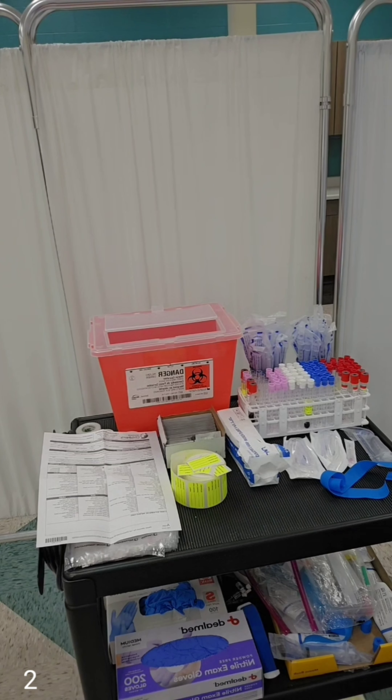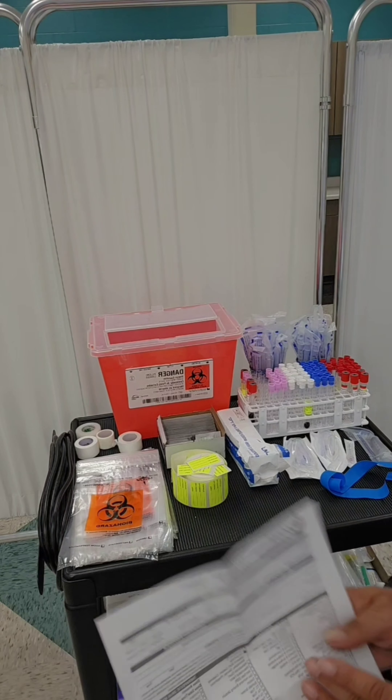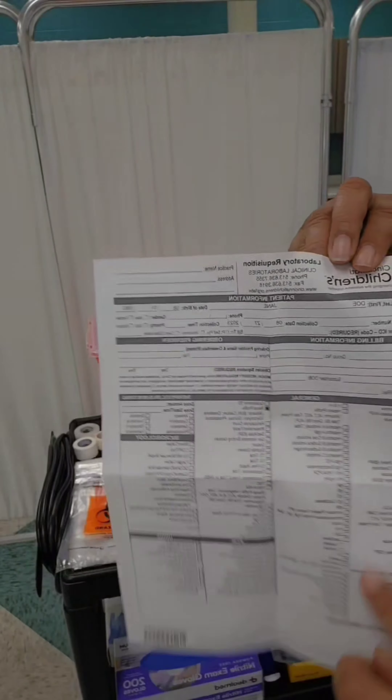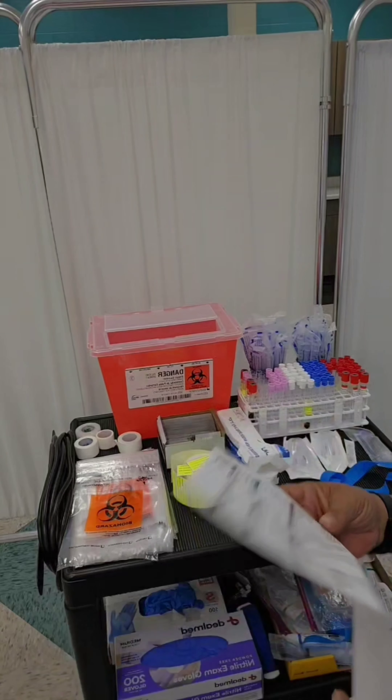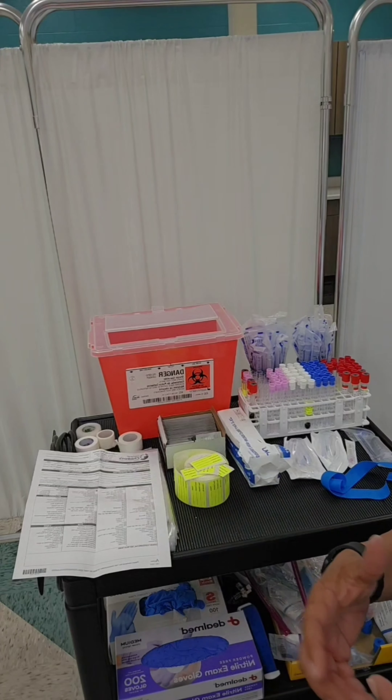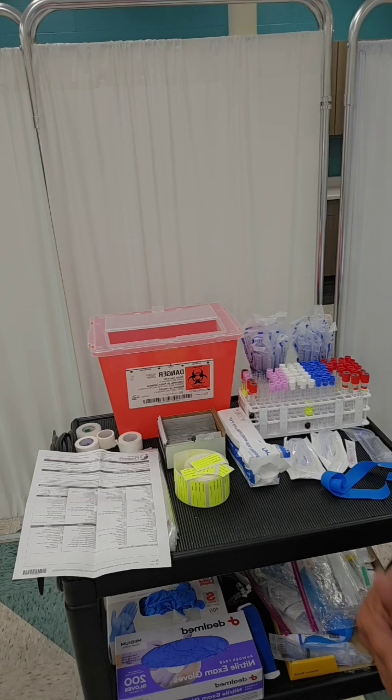When you are setting up to do venipuncture, the first thing that you want to do of course is read your lab requisition form or your doctor's orders. This is similar to what a lab requisition form will look like — it has all of the laboratory tests and whichever one the doctor wants will be marked. Or you can just have a regular doctor's order stating which lab needs to be drawn.